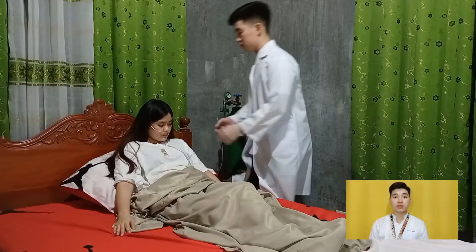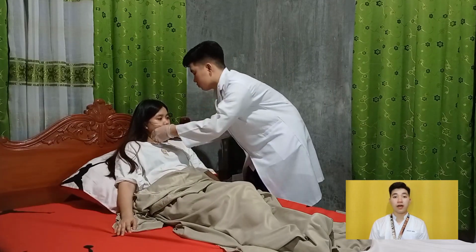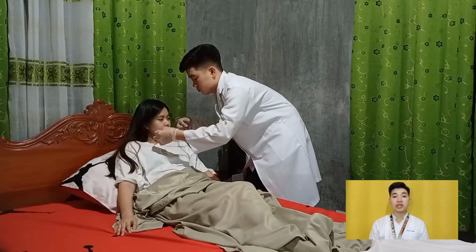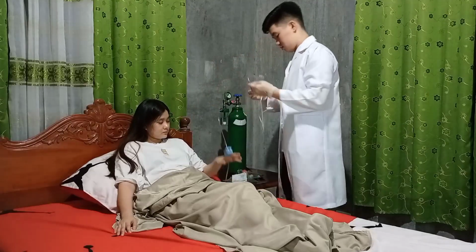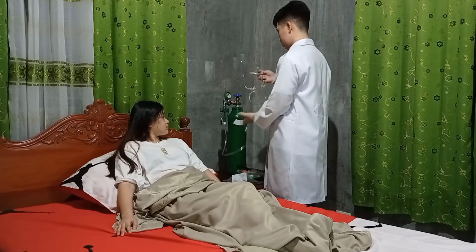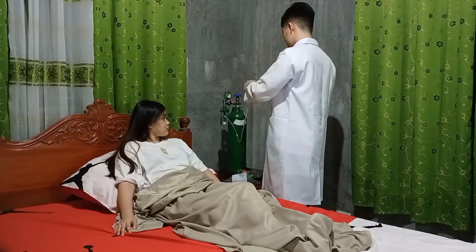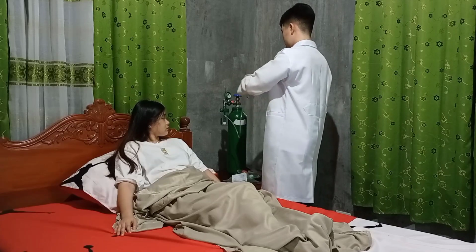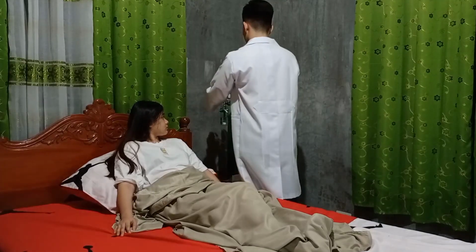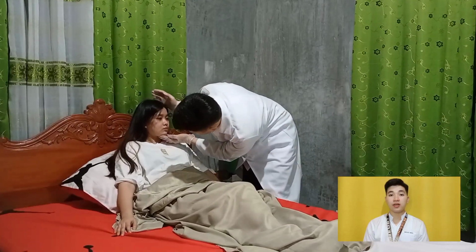Put on clean gloves, remove and clean the cannula, and assess the nares at least every 8 hours, or according to agency recommendations. Check the nares for evidence of irritation or bleeding.